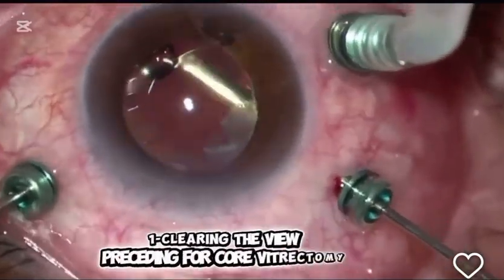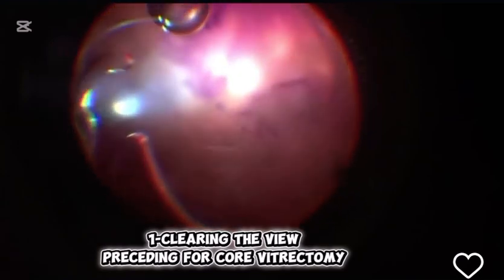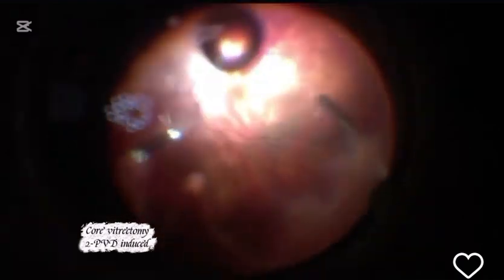Plan a vitrectomy in a simple recurrent vitreous hemorrhage, known case of myopia with diabetic retinopathy. So after the pars plana approach, separation of the anterior hyaloid from the posterior hyaloid in order to clear the view and proceed directly for core vitrectomy all around.